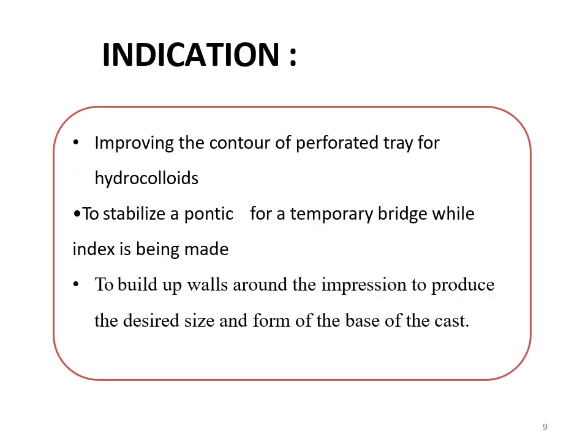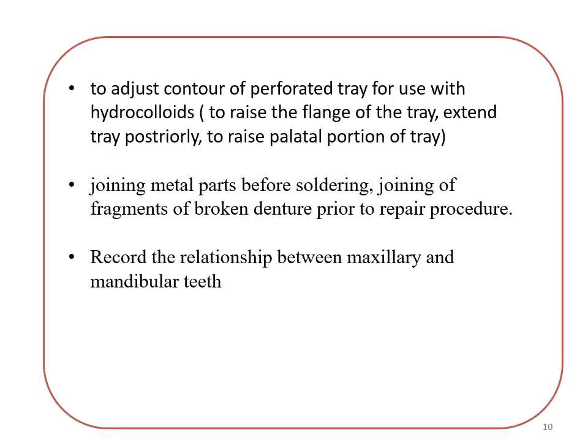Indications. Improve the contour of perforated tray for hydrocolloids, to stabilize a pontic for the temporary bridge while the index is being made, to build up walls around the impression to produce a desired size and form of the base of the cast. To adjust the contour of perforated tray for use with hydrocolloids, to raise the flange of the tray, extend the tray posteriorly, to raise the palatal portion of the tray.